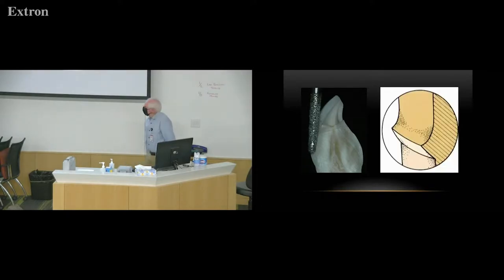And that's what a chamfer looks like up close. So you'll be living with us in fixed prosthodontics for the rest of your career, and you're going to learn today how to produce that. If you're not sure exactly how to do it, we've got plenty of faculty here to help you out.